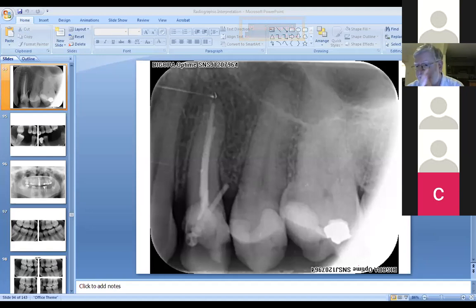I feel sad that certainly at Griffiths on clinic, you guys don't have those bite wing tabs, but you've got bite wing foam, and you can stick that bite wing foam on your radiographs and get the patient to close. And when you're getting the patient to close, it's helping you to assess. But look at occlusion before you start. When you're needing to build up a tooth, MODO, anteriors, whatever you're doing, get the patient to close. Have your mirror in the mouth. Look at how things are to start with.